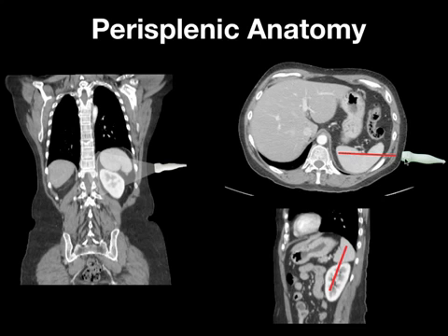What you want to be careful of is not being too far back and then angling anteriorly, because you're going to bring the stomach into view, which could be confusing, since frequently these patients have full stomachs, which could pose a diagnostic dilemma in terms of the presence or absence of free fluid.